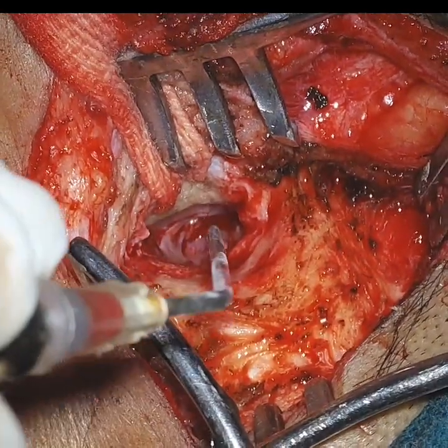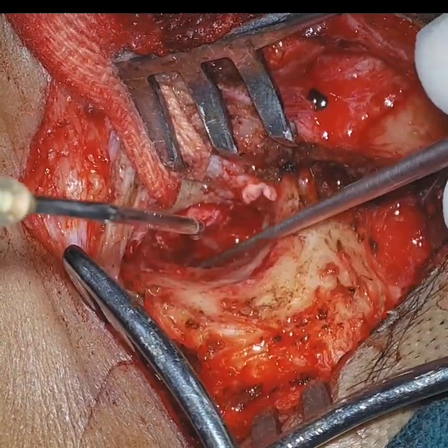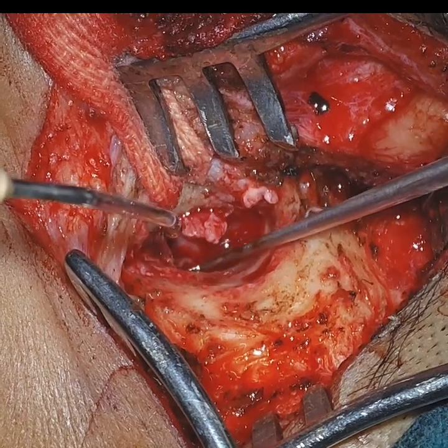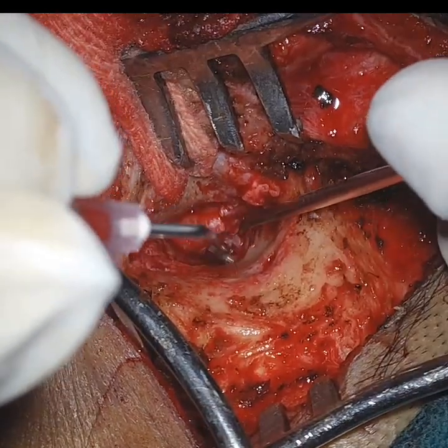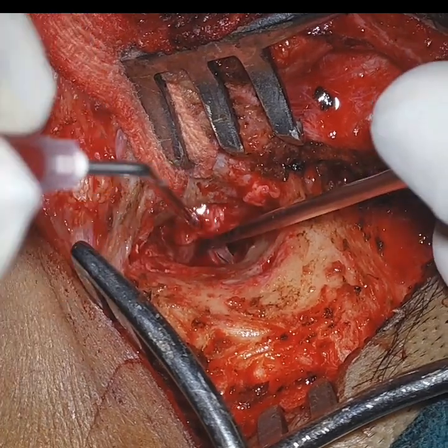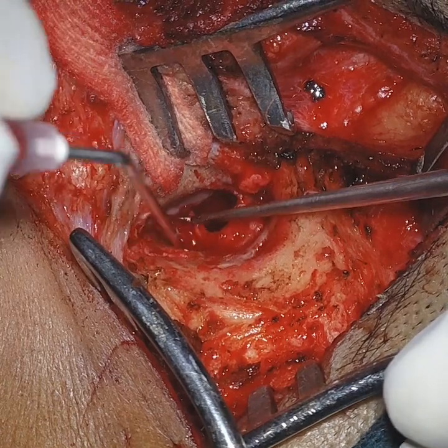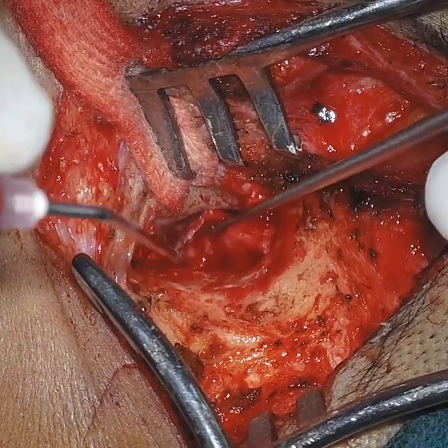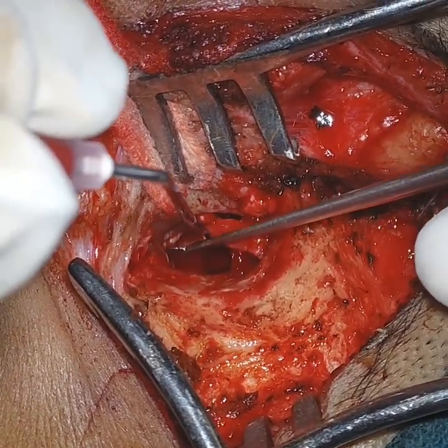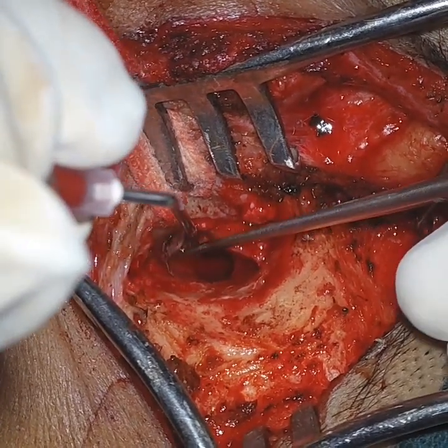wall mastoidectomy. So before proceeding to the main surgery, first of all, we are just raising an underlay flap because in this patient we are planning for a primary ossiculoplasty with TORP. So for that, it is utmost important to raise the underlay flap so that we want assurance that tympanic membrane graft uptake should be there. For that, underlay tympanoplasty gives very good results.